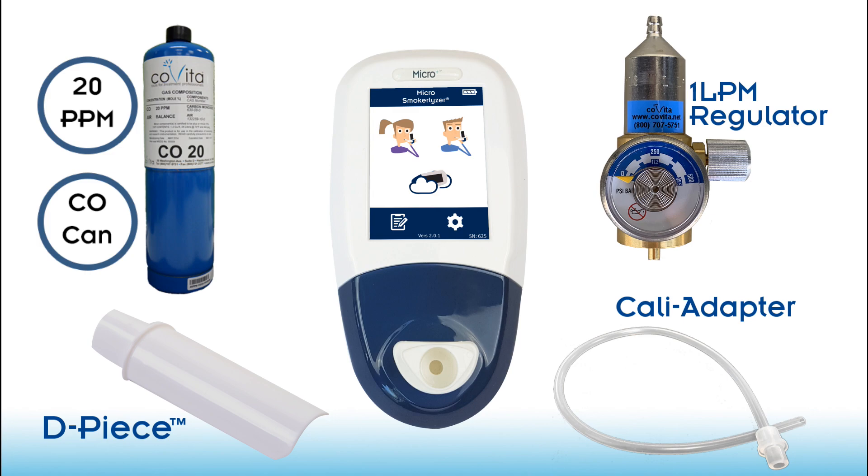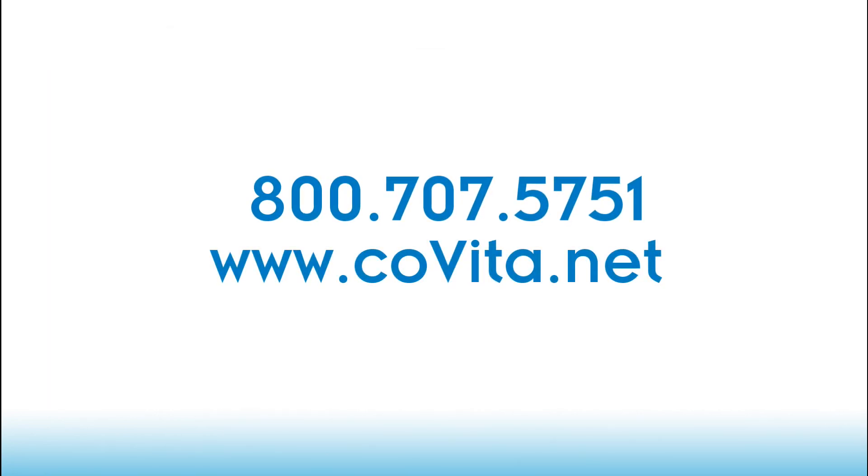Now that we have all our supplies, we can begin the calibration steps. If you are missing any of these items, feel free to give us a call here at Covita or go to our website to place an order.